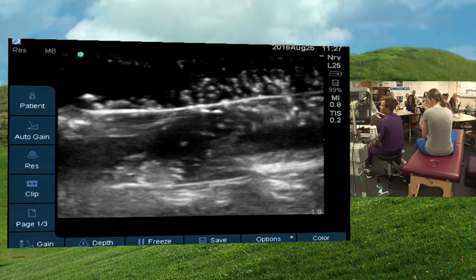I think it would be difficult. I think you would have problems with the catheter not threading because of the vein getting smaller. But I don't know that. Obviously, that's not a hard and fast rule. That's a great question.